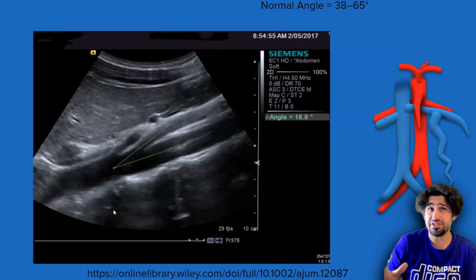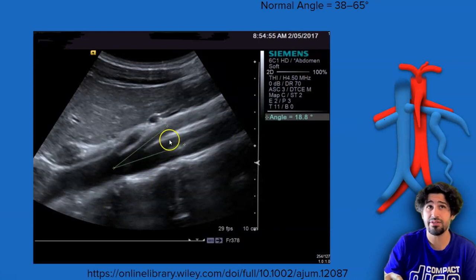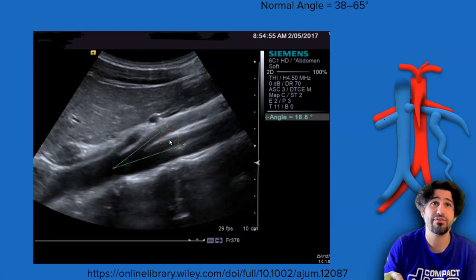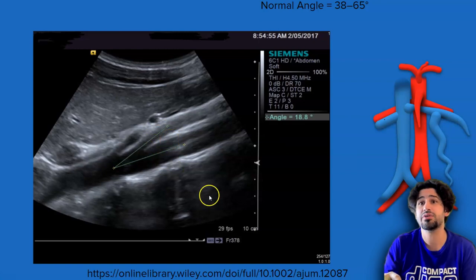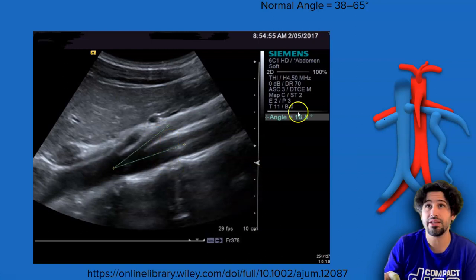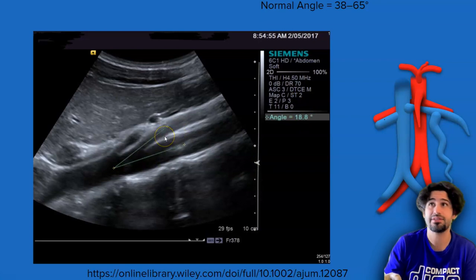Sonographically, in sagittal, you'll see a small angle from the SMA to the aorta. Normal angle is anywhere from 38 to 65 degrees. Here you can see on this one the angle is 18.8 degrees. The left renal vein should be there — you can barely see it because it's compressed.